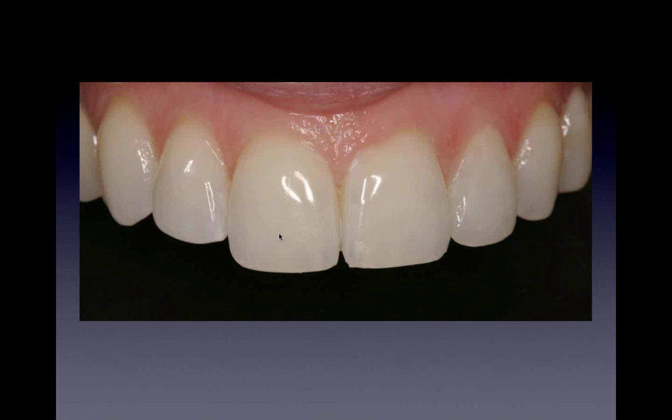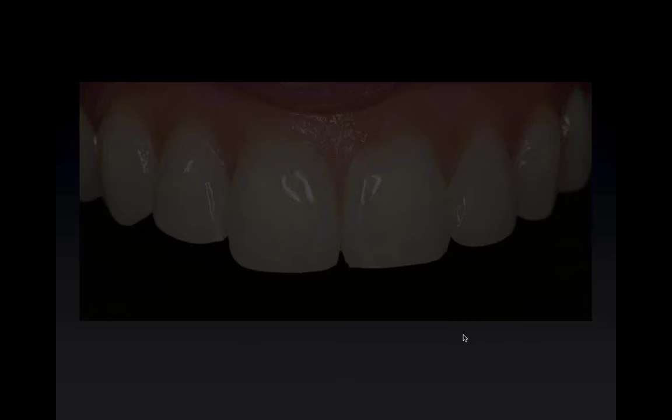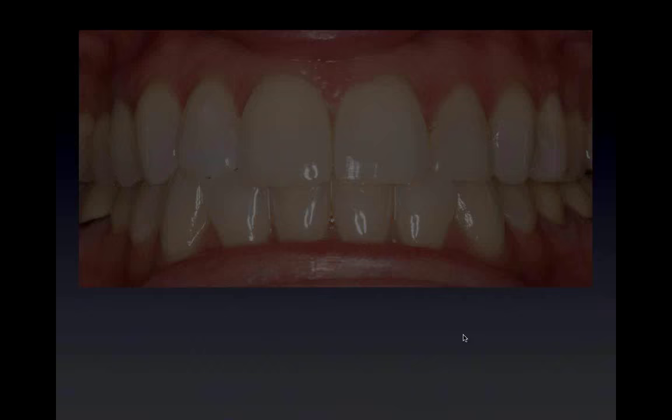It brings it forward into the plane of the smile. If you go back, you see it was tucked in there. So we basically prepared it all the way up to that spot and then added it to the rest of it and just polished it up. So that's an easy fix, but it really makes a difference for her smile.